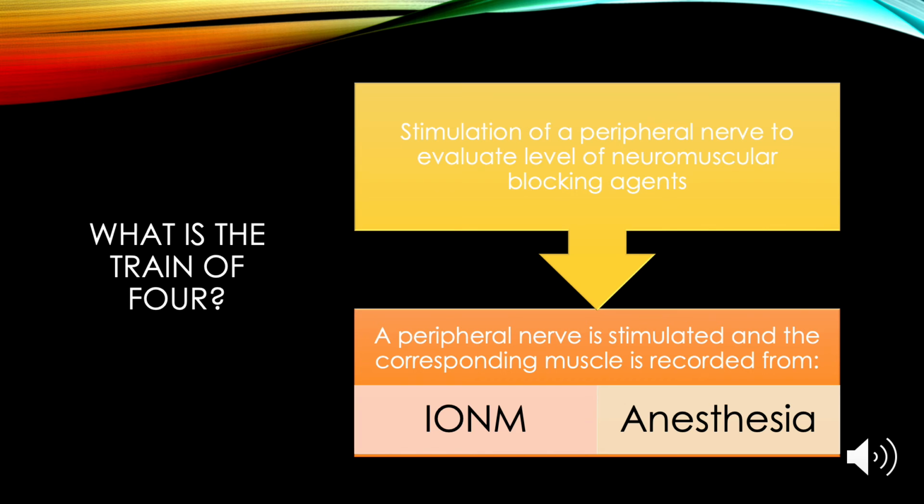All right, we are officially at the second part of this presentation. I promise it's not as long as the first part. Okay, so because the monitoring of motor evoked potentials and electromyography requires an intact neuromuscular junction that's not inhibited by any muscle relaxant or neuromuscular blockade, there is also a specific modality that is used to monitor the amount of blockade that's present within the neuromuscular junction.